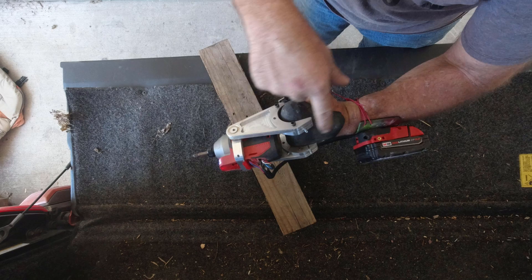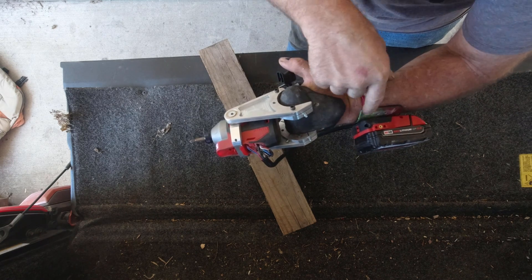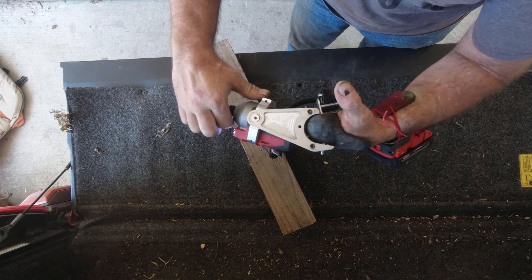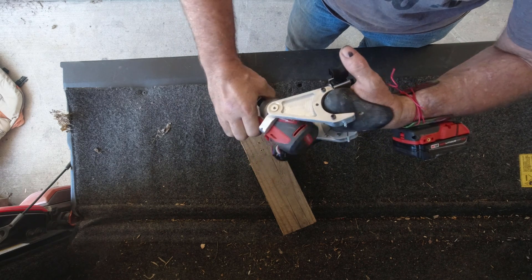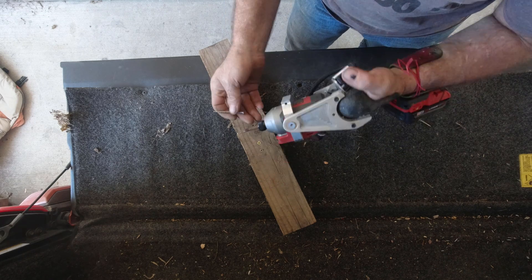Eventually, after I do cable management and such, I'll have linkage so that when I bend my wrist forward and backwards, it articulates 90 degrees. Right now I'm just going to lock it in the straight position.